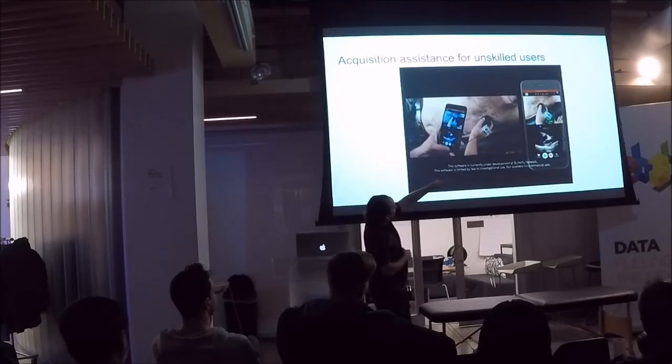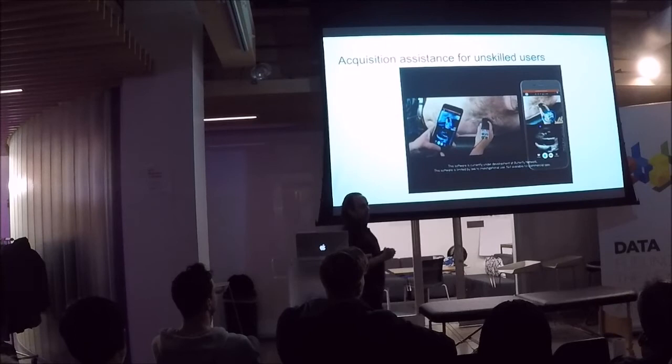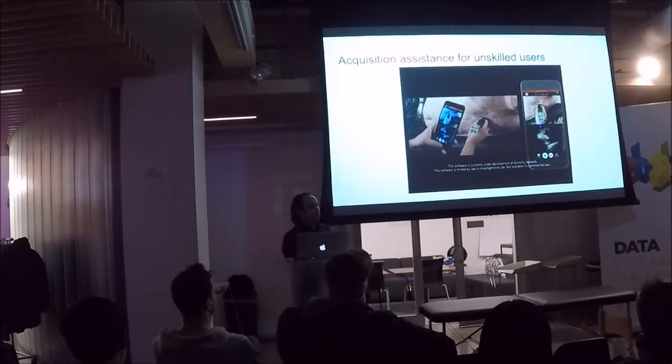The iPhone screen has been mirrored here, so you'll be able to see when we've found the right image: you'll see a green check mark. And when the probe is moved off or turned in the wrong direction, you'll see these augmented reality arrows indicating to the user exactly how to move the probe to find the correct image.